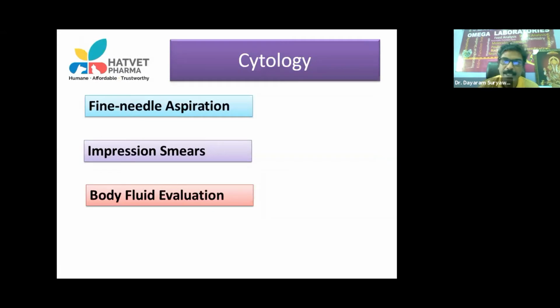So, directly we can start with our topic, cytology. Cytology comes under three different categories. We can divide cytology into three categories: fine needle aspiration cytology, impression smear cytology, and body fluid evaluation. These three things we are going to discuss in today's webinar.